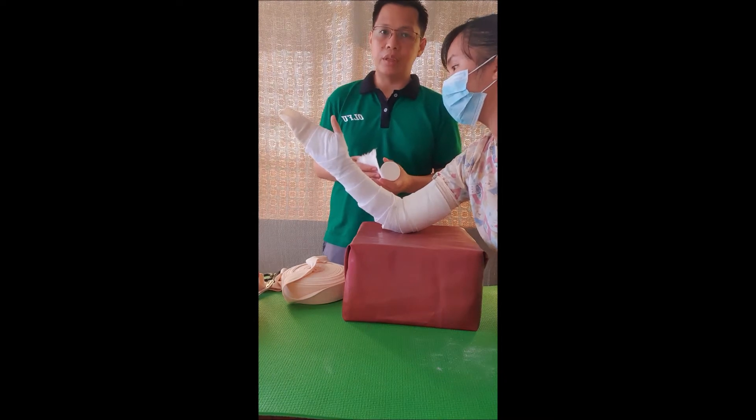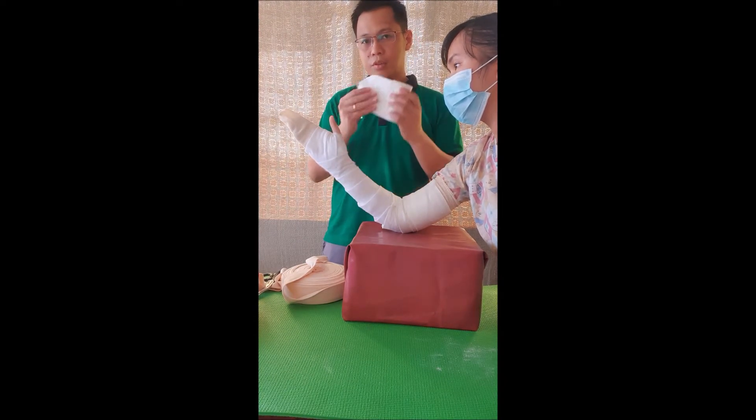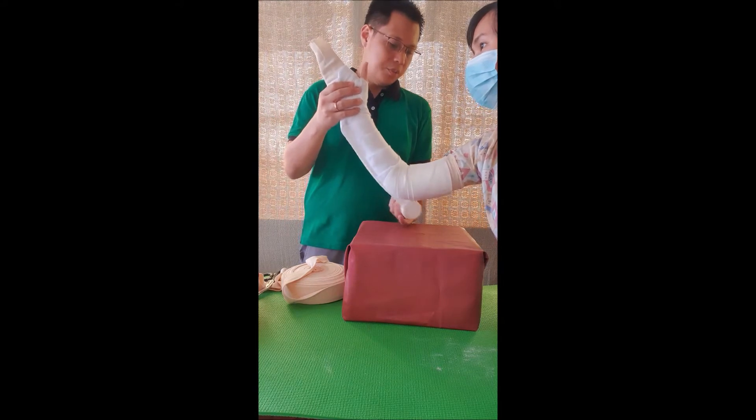We will now determine the length of the cast needed for this patient. We will use the wadding sheet as a template for our slab and measure along the metacarpal area going proximally.